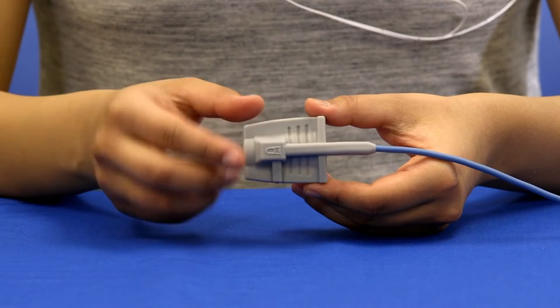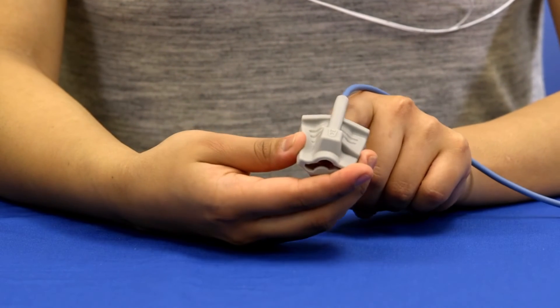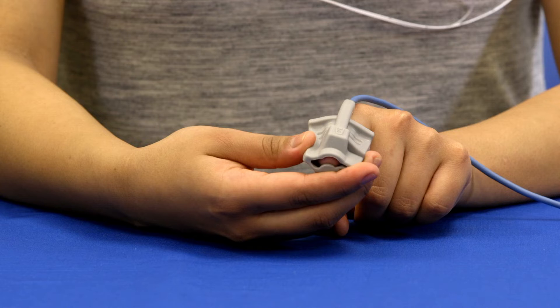Place the oximeter finger sensor on the index finger of either hand with the cable running over the back of your hand. Your finger should go to the end of the sensor but not through the cutout at the end.